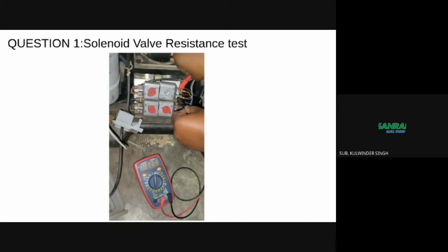If there are no disconnections, then you can proceed to troubleshoot the control board to identify if any components which can be replaced are damaged or not. If the damaged components on the board can be replaced by soldering, then you should replace them. If they cannot be replaced by soldering, then you should replace the whole control board. However, if the valve is receiving the rated voltage but is not getting energized, then the solenoid valve is faulty. You should replace the coil.